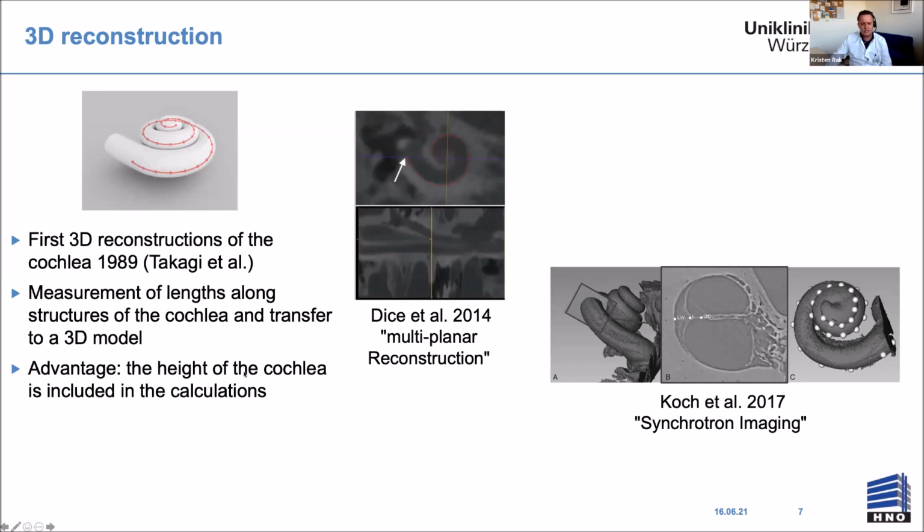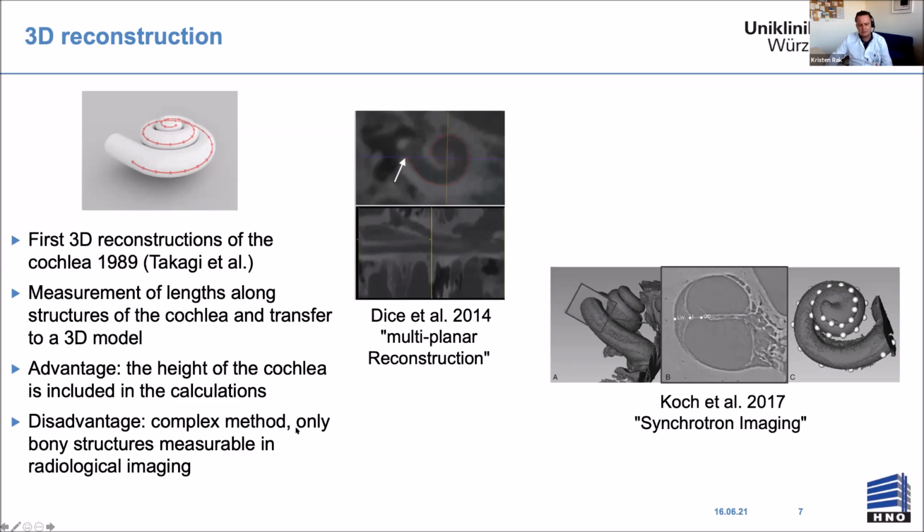Here, the advantage is really that the height of the cochlea is included in the calculation, but there are also some disadvantages because it's really complex and it can only be performed in bony structures.